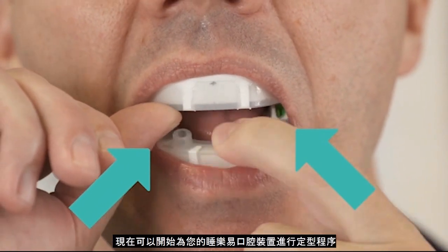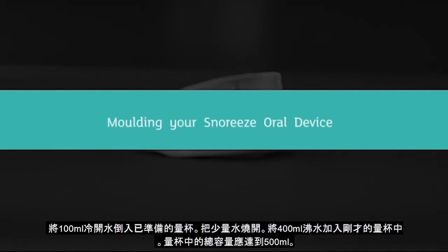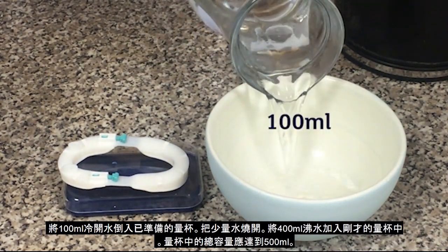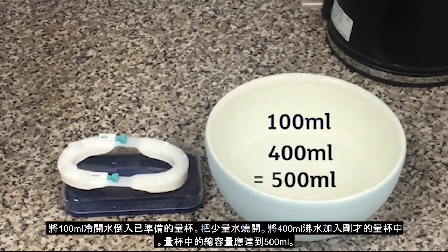Now that you have everything ready, it's time to mould your Snoreeze Oral Device. Fill a bowl with 100ml of cold tap water, then add 400ml of boiling water. There should be 500ml of water in the bowl altogether.